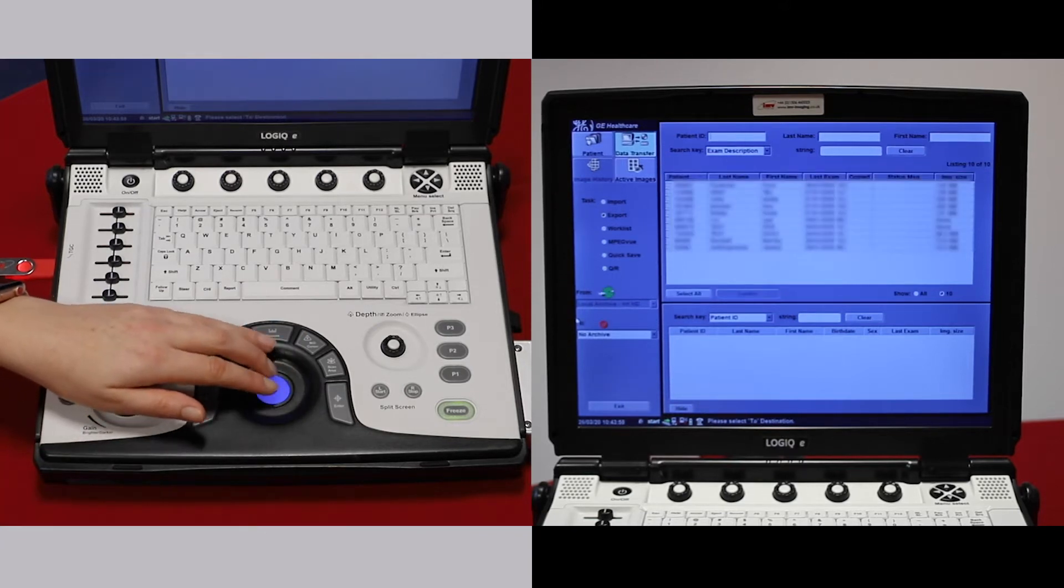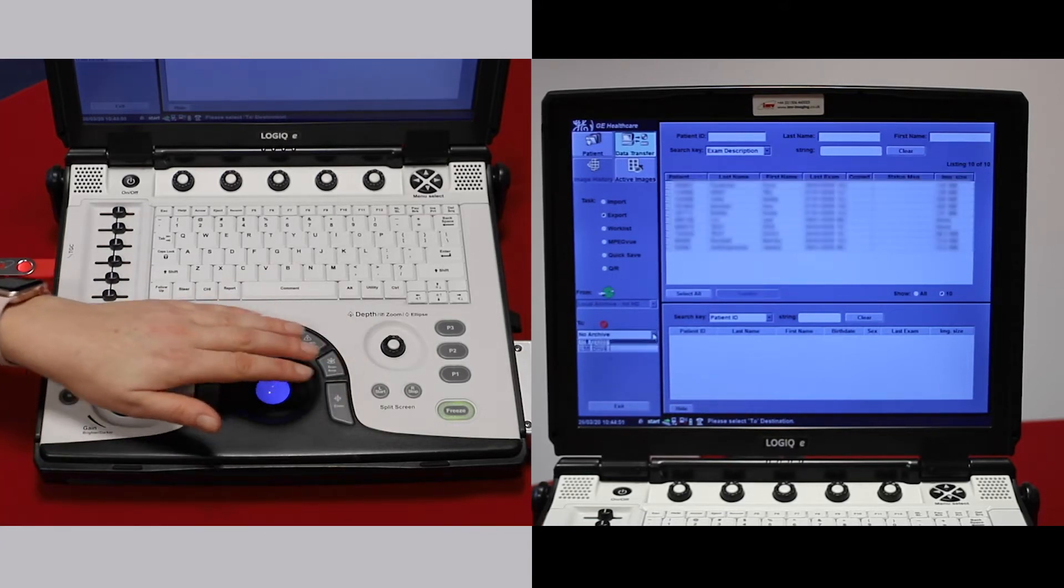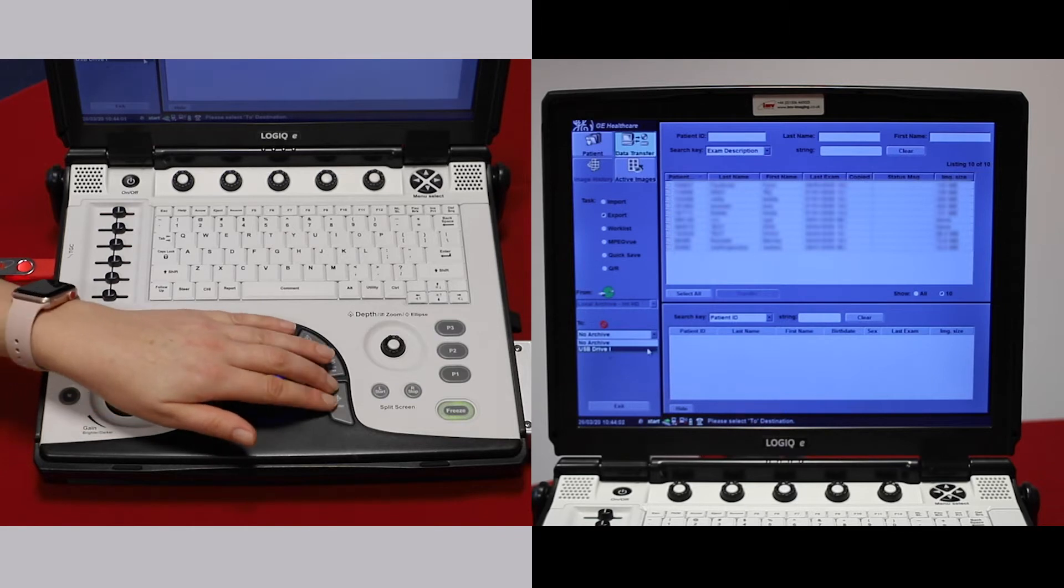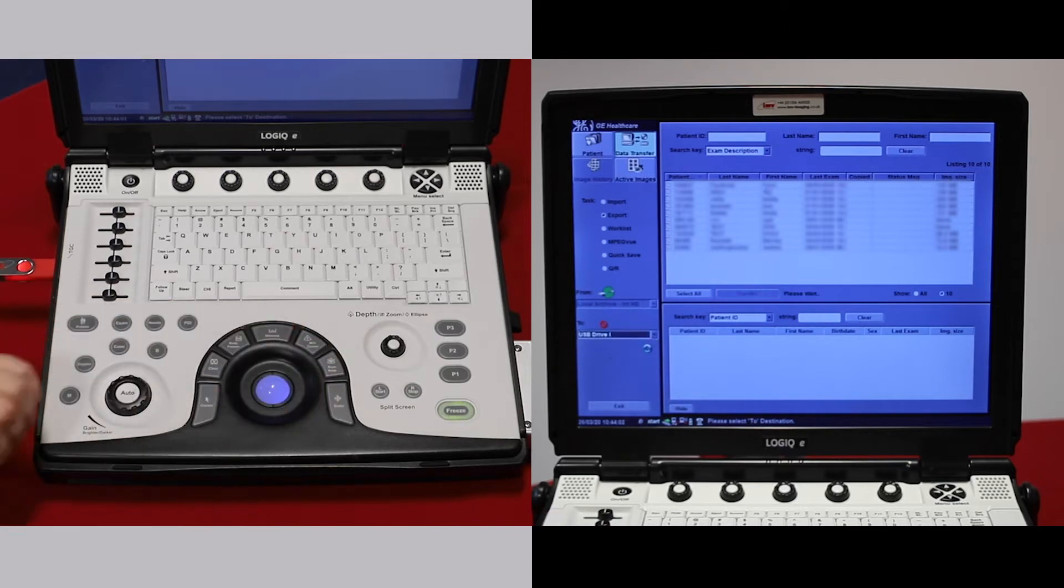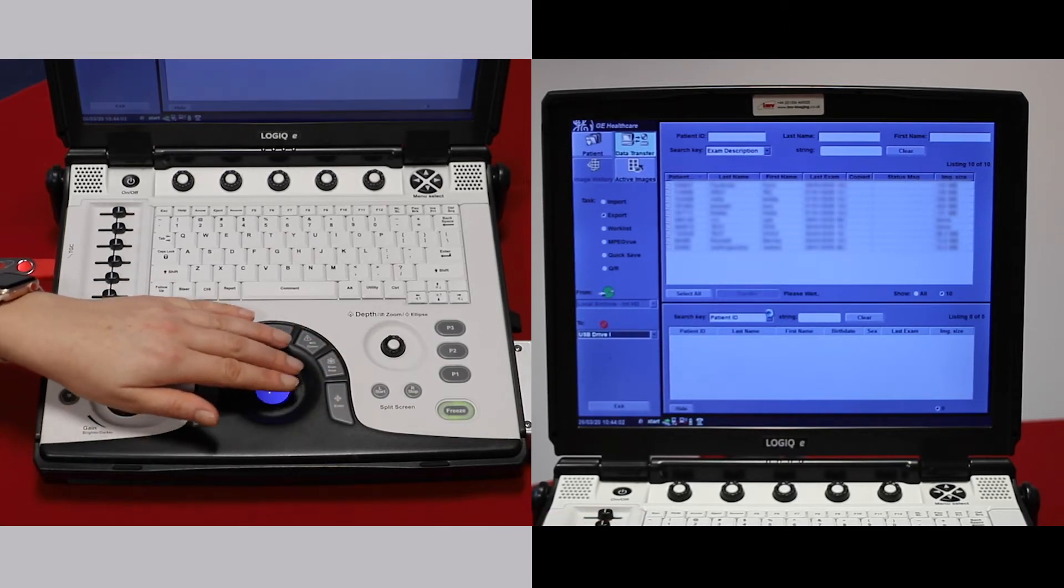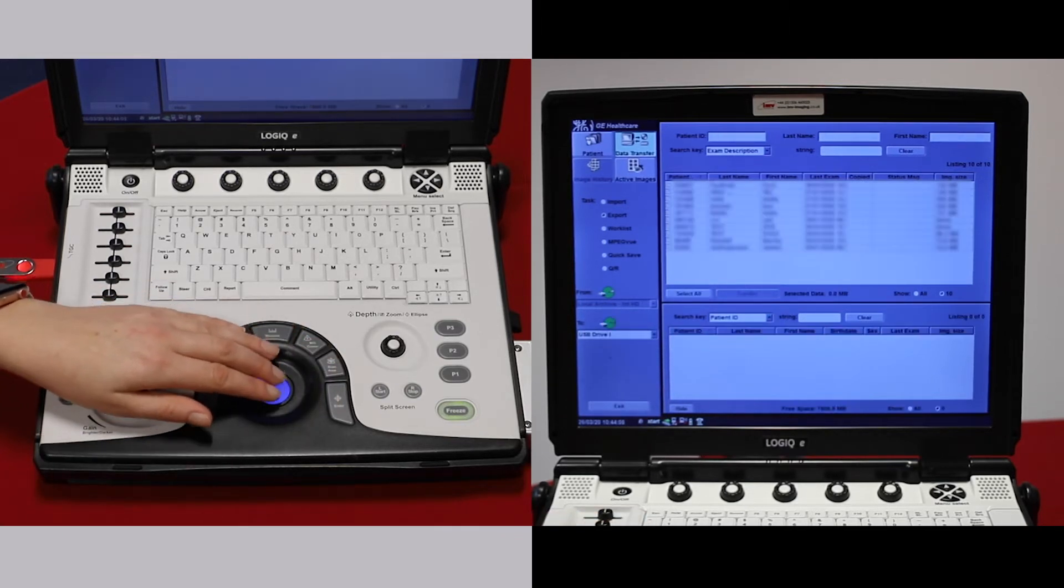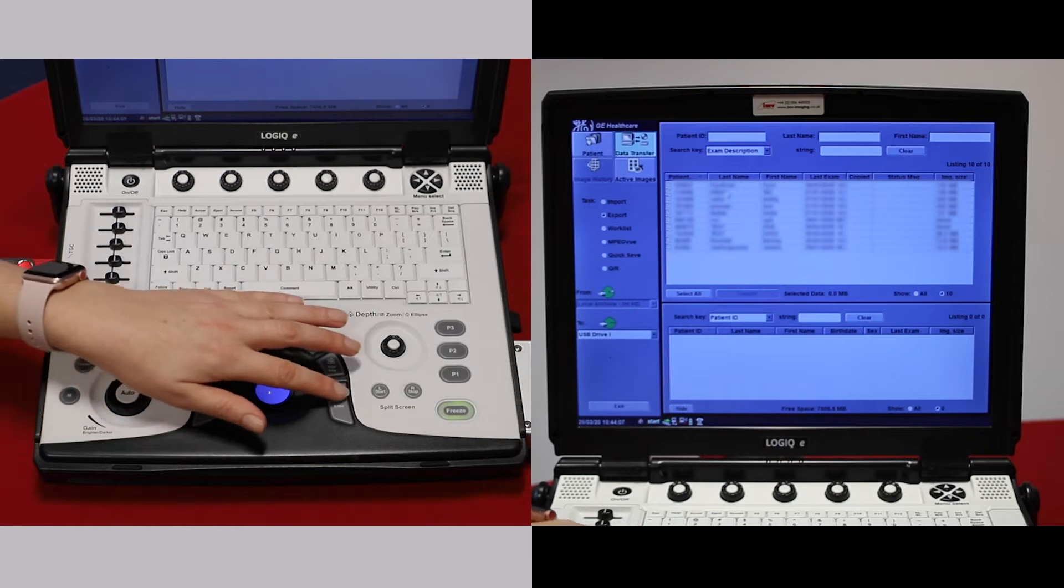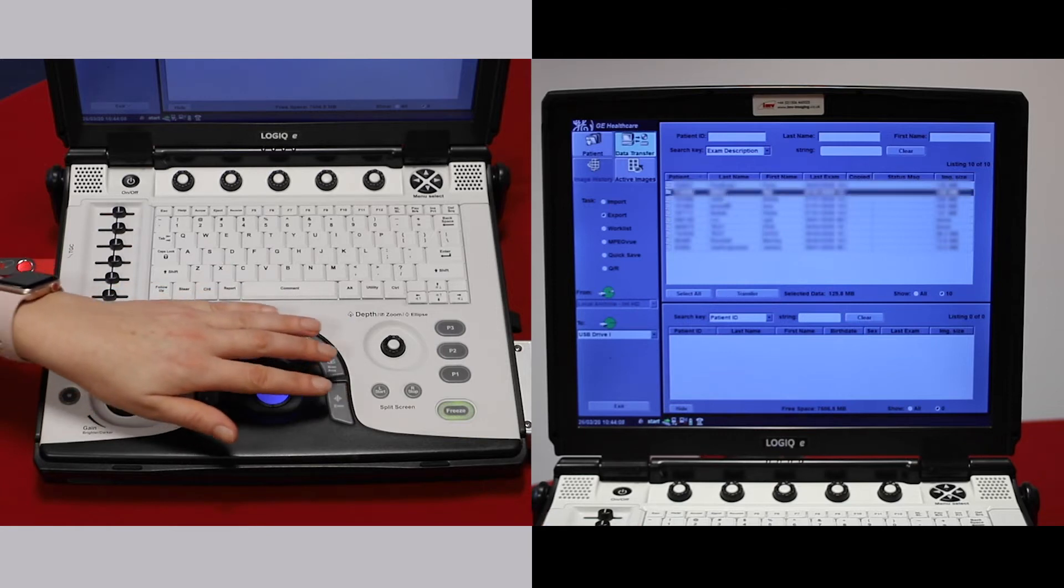Export, choose your media, and select the patients you would like to export.